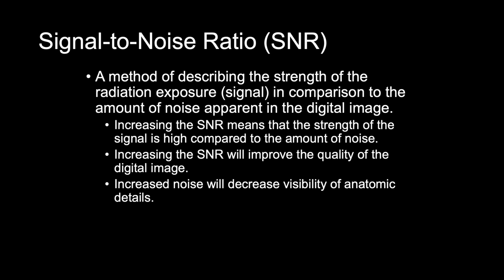Increased noise will decrease the visibility of the anatomic details. So if you increase the SNR, it will improve image quality, but it will also increase patient radiation exposure. If you decrease the SNR, it decreases the image quality, but it also decreases patient exposure.